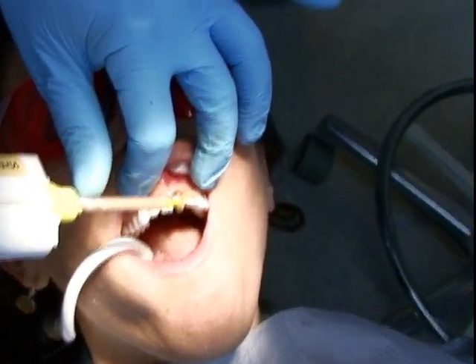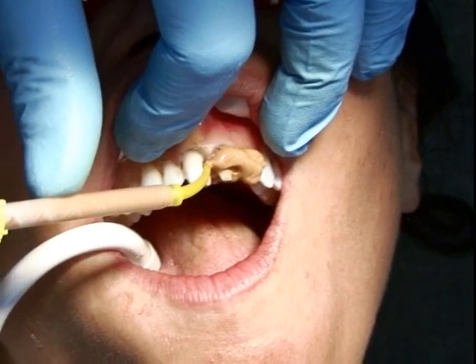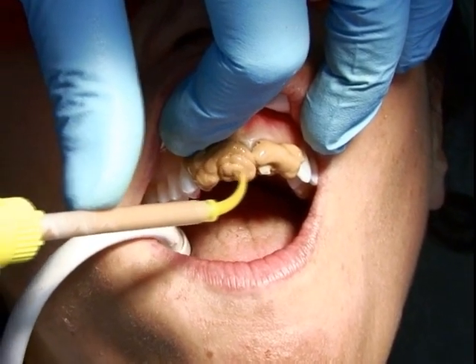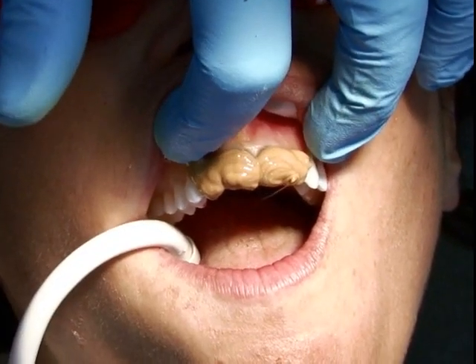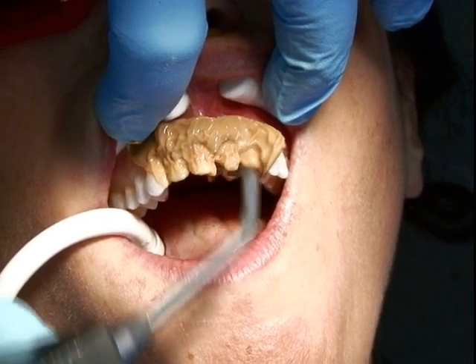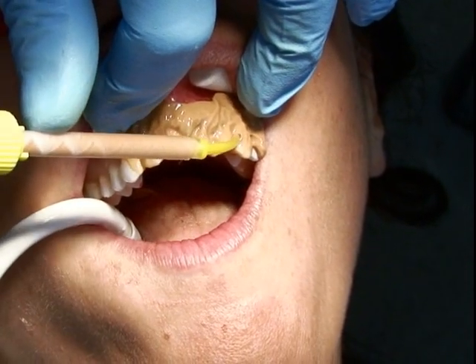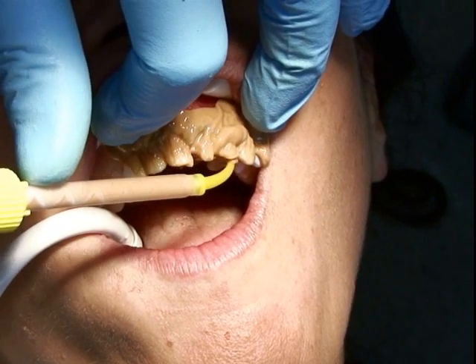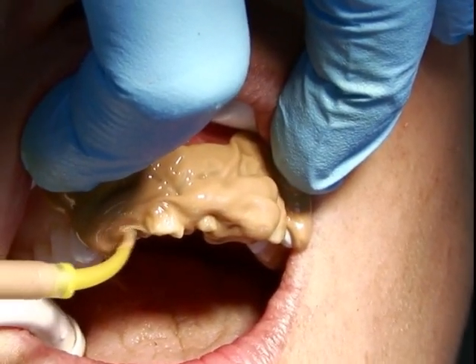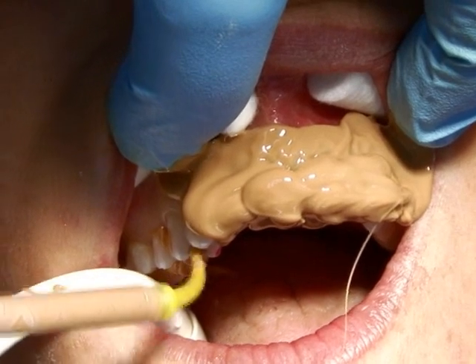We're now at the impression stage. Notice the thumb support on the syringe for stability — squeeze very firmly so material comes out quickly, immersing the tip right at the margin and keeping it immersed in the material as it goes around the teeth. Because we have sharp edges, we'll do some air syringing — blow air in and around the teeth smoothly so you don't incorporate bubbles — which picks up those sharp edges much better. Then re-inject quickly and firmly all around the teeth, and incorporate the occlusal surfaces of the posterior teeth to minimize trapping of bubbles.